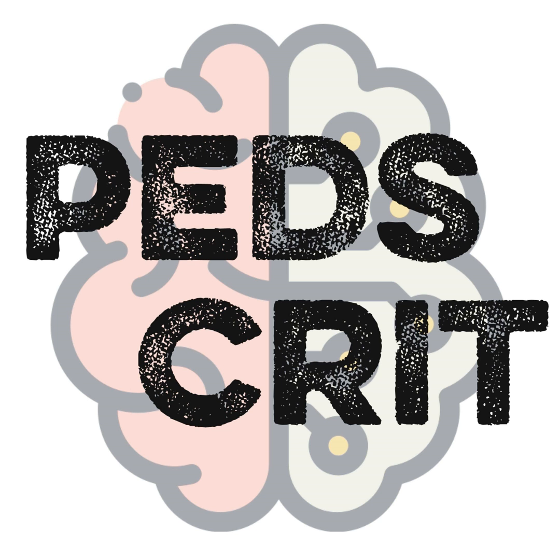And then as the program gets more familiar, it's not just the PICU fellow and PICU attending, but also the respiratory therapists and the nurses looking and saying, I think we need to shorten this T low. Do you look at tidal volumes the same way? So-called release volumes? Do you try to make sure you're not getting more than 8 per kilo of a release volume, or not necessarily? Yeah, I think that's an important number to look at as well. The recommendations that are out there do recommend between 6 and 8 ml per kilo of that release volume. So that's another thing to look at when you're adjusting settings. It might help you determine your P high and your T low.